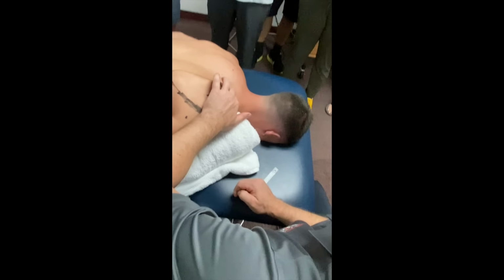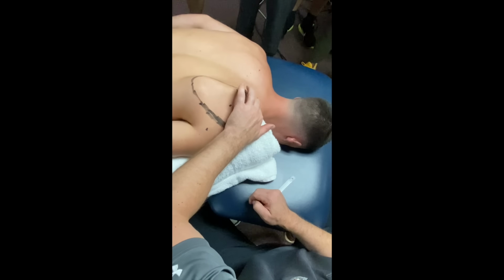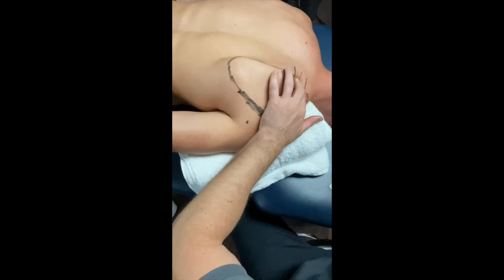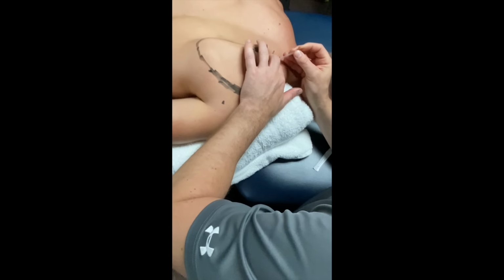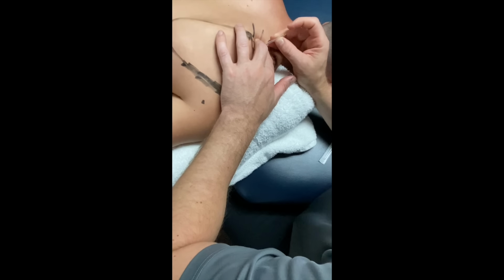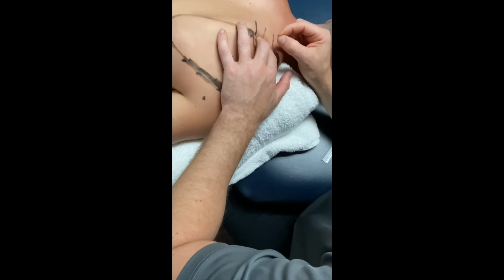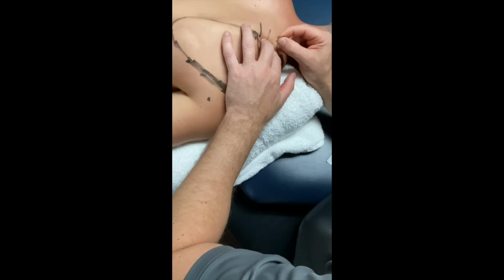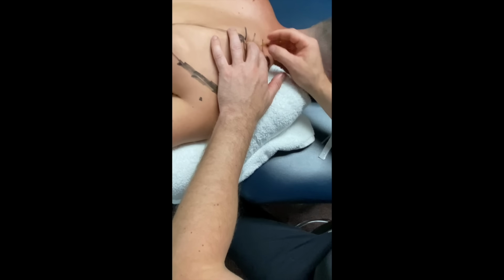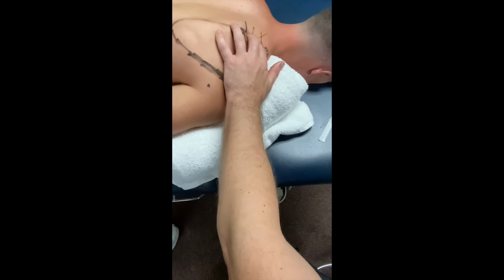But just like yesterday, I'm gonna take this tissue and I'm just gonna pull it from the vertebral border onto the back of the scapula. And now I'm gonna take my needle, go in between my fingernails, and I'm gonna needle onto the back of the scapula as close to the border as possible without being over it. I am hitting the bone. It is less than 20 millimeters. I'm solid.